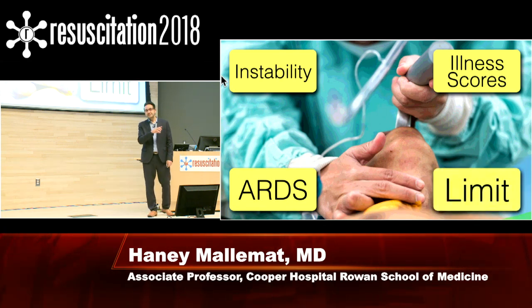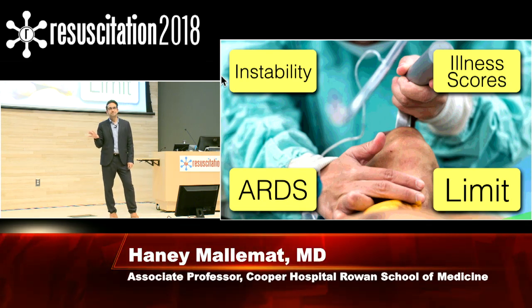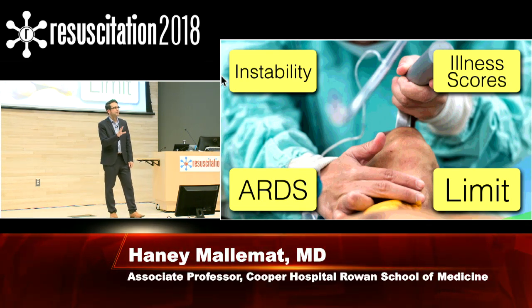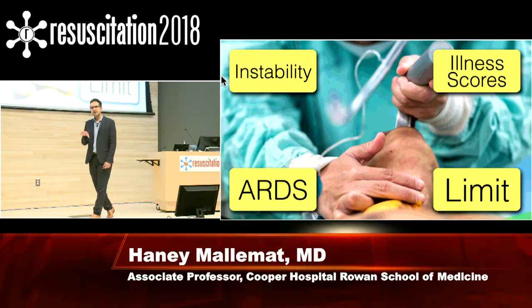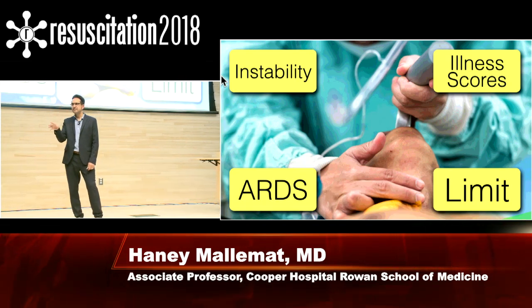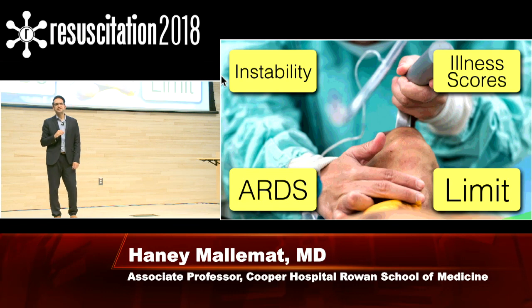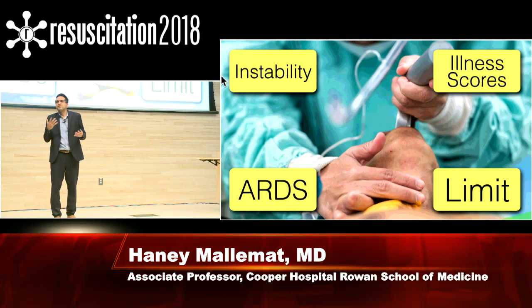And then finally, the last thing I'll say about when to determine intubation for these patients, and this is a little bit of a gray zone thing, but whenever you meet a patient who's going to be on non-invasive ventilation, I try to give them a time that I'm going to give them on the therapy. In other words, I had a patient last night who was sick. I told that person, you're going to have 45 minutes of non-invasive ventilation. 45 because that's just what felt right to me.